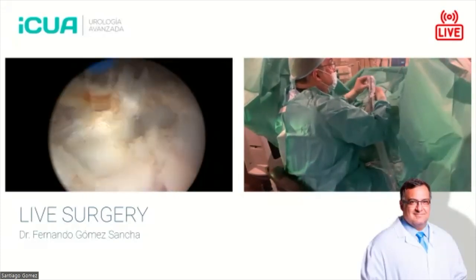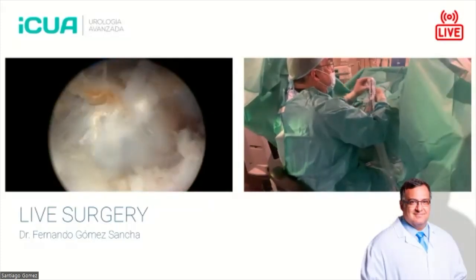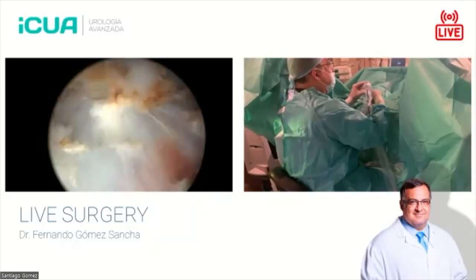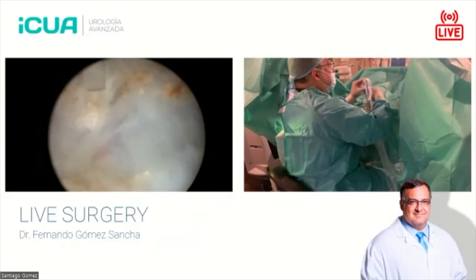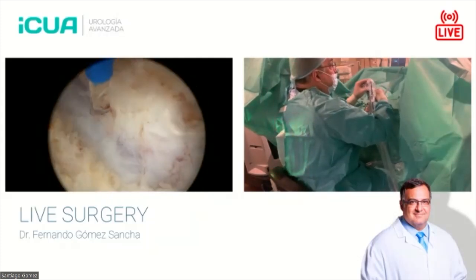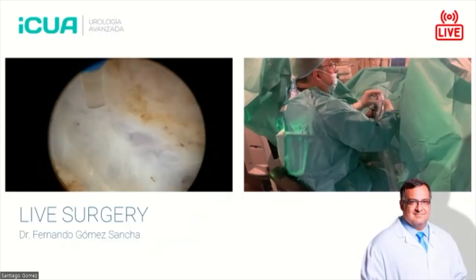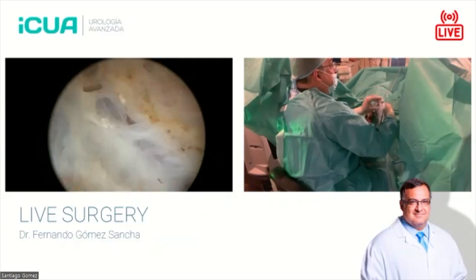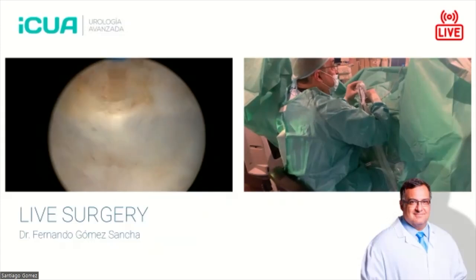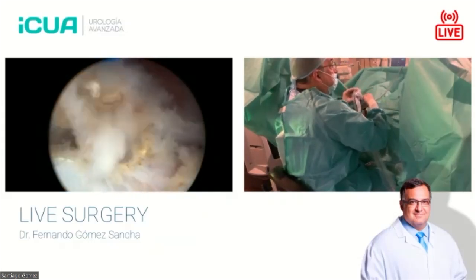and some of these nodules can. So instead of thinking of a billiard ball, we think of a fruit. No, it's not always perfect, and we have to judge. Of course, this plane looks very flimsy. It looks very, very thin. So I have to be careful, and I have to target my laser properly so I don't target it against the capsule, but closer to the edge of the adenoma, so the energy doesn't deepen the dissection too much.